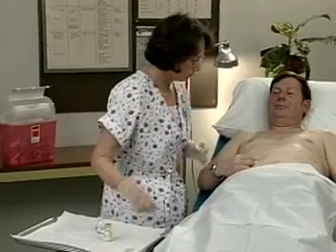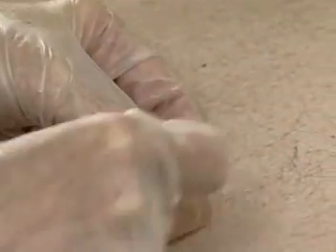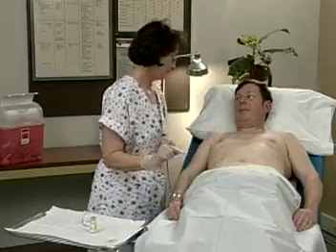All right, let's see what that looks like now. Put a little Band-Aid on that. Good. There you are. All done now. You can go ahead and get dressed. Discard used equipment.